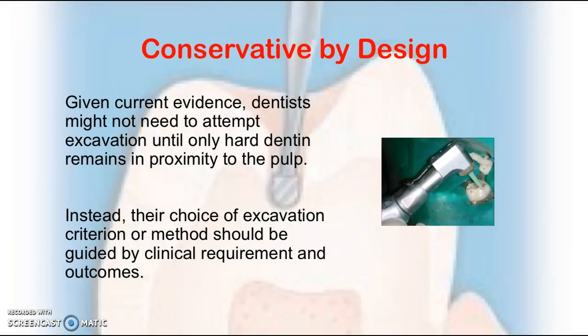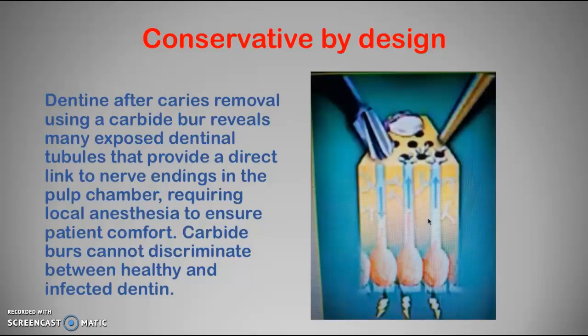Given current evidence, dentists might not need to attempt excavation until only hard dentine remains in proximity to the pulp. Instead, their choice of excavation criteria or method should be guided by clinical requirements and outcomes. So let's take a look at the function of the polymer burr.